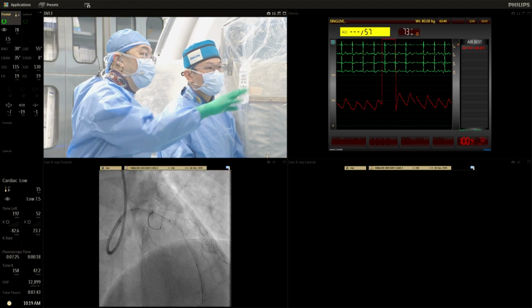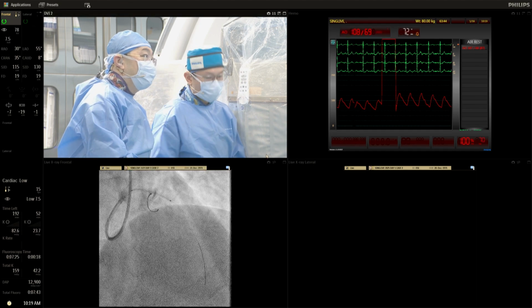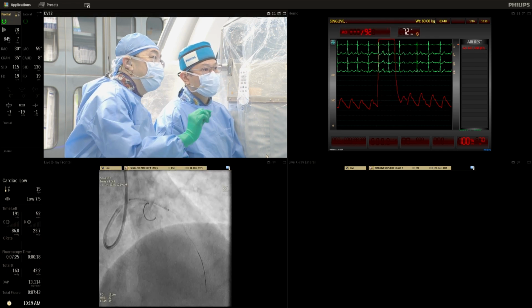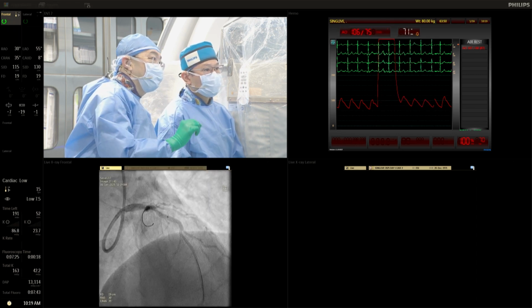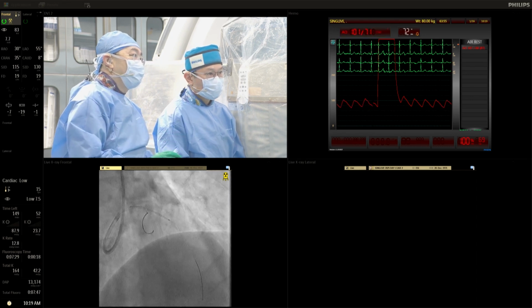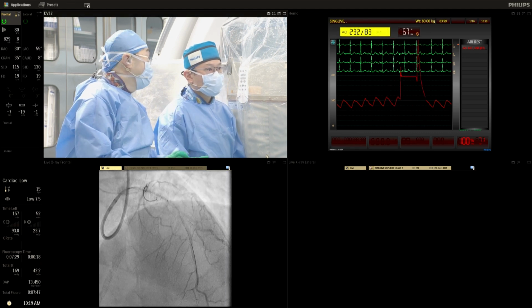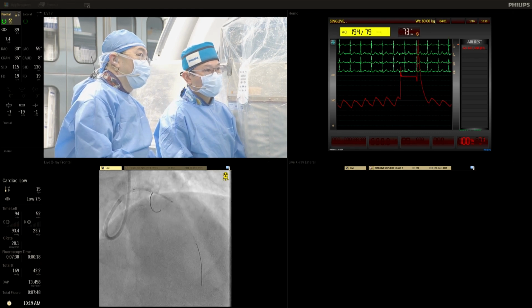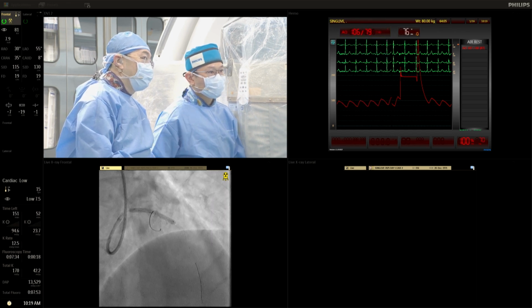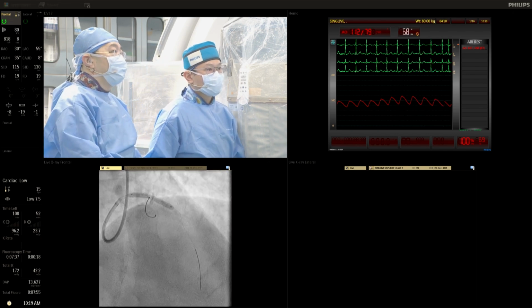So we measured. This is what we wanted, right? Okay, maybe go in just slightly. Okay, one more time. 12.